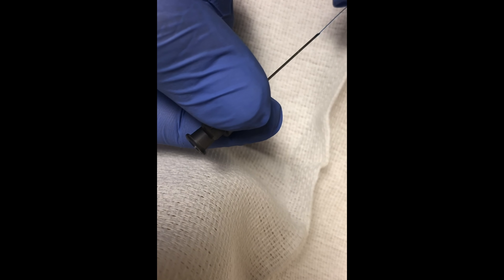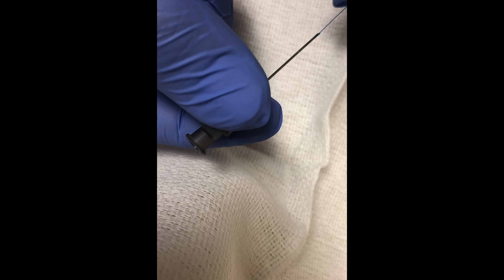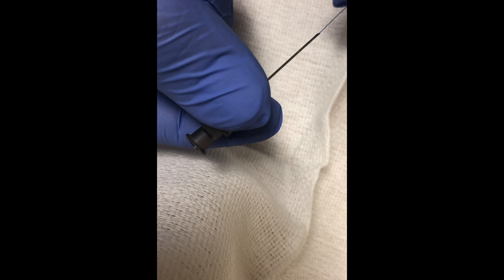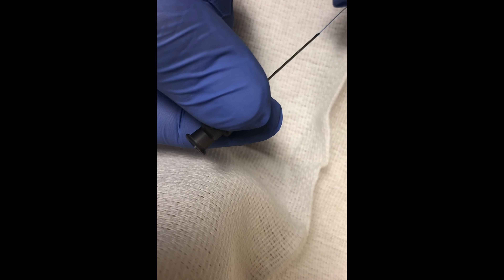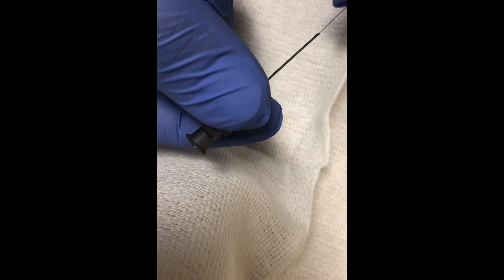After hopefully anesthetizing the wound, go ahead and preload your thread through a hollow beveled needle large enough to accept the thread. I'm using a 22-gauge needle, and for demonstration purposes I'm threading the thread through the beveled needle tip, but you can load through the other end of the hub as well. Just don't get poked.